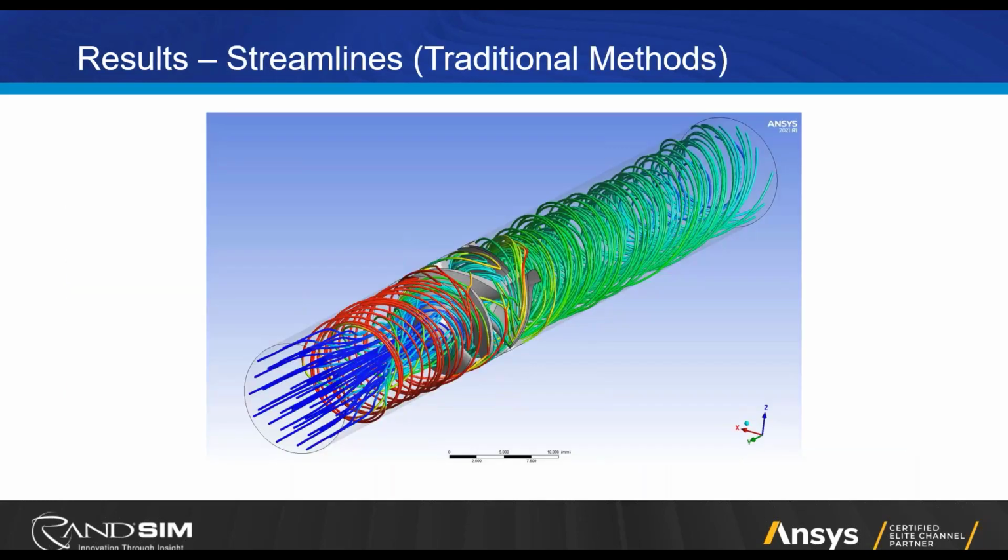Next slide, please. Okay. So, this streamline plot is typically used to get an idea of what the flow is doing in 3D, and generally it's very insightful. But you can see in this case, it just looks kind of like a mess. A lot of spinning, swirling. You can't really tell what's happening. But one thing that is interesting is the amount of pre-swirl that's evident here. You see the red upstream of the impeller. So we're actually inducing swirl in the flow prior to the flow getting into the device. And that's going to be important when we talk about blood damage shortly.